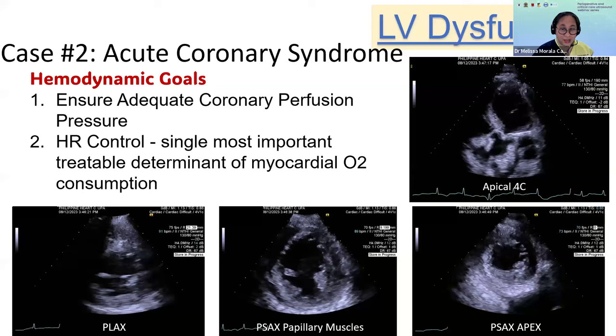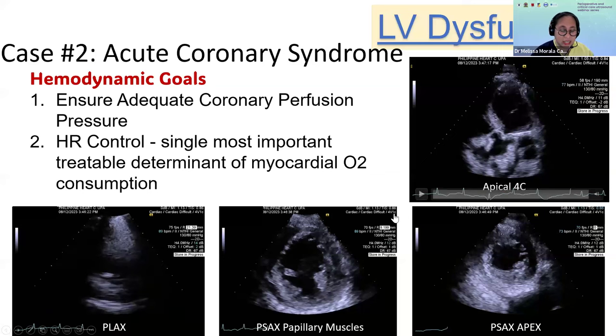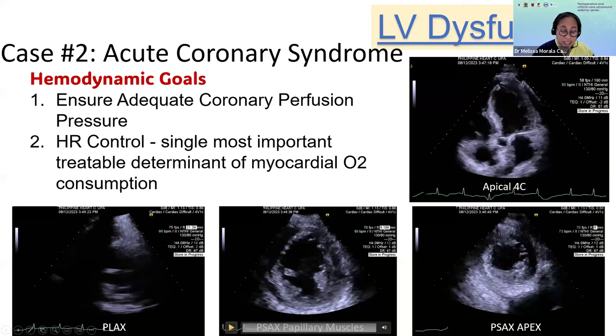We have discussed a while ago pericardial effusion, impeding venous return. Now we are dealing with LV dysfunction. So the correct answer is C, myocardial infarction. Now, in POCUS, we need not obtain all the views, only those which will show significant findings warranting anesthesia intraoperative intervention. This patient has long been exhibiting symptoms of coronary artery disease.